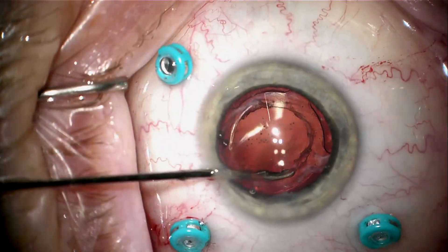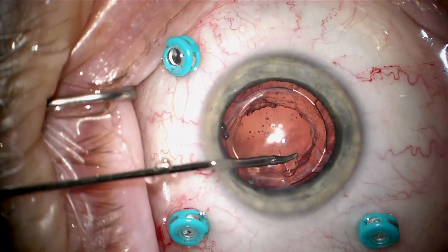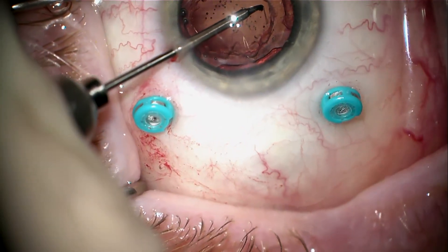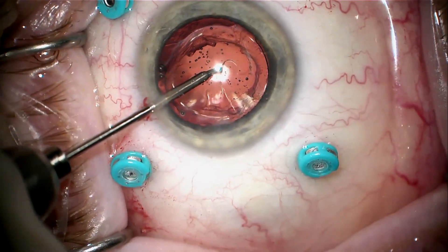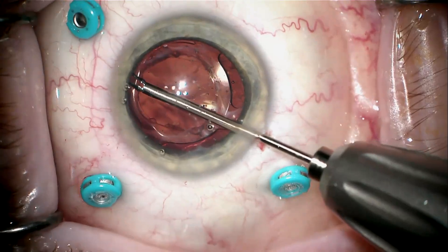I first dissected the rhexis off the anterior capsule with viscoelastic. Now I'm doing the other side — I make a little cut, grab it, and extend this tear in a circumferential fashion to make the anterior capsule opening a little bit bigger, so it'll be safer to go ahead and take this lens out.